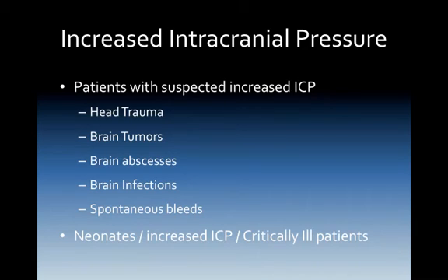So if they're looking like that they're posturing up and you have a rapid increase in intracranial pressure, very simply, you could hyperventilate them a little bit and see if it subsided that increased ICP. Don't get extreme with this. Don't take them to extreme ends. So monitor. You want to just adjust it very, very little. So towards the lower end, maybe at 35, maybe at 32, 34. Start off with that, see how your patient does and interacts clinically.